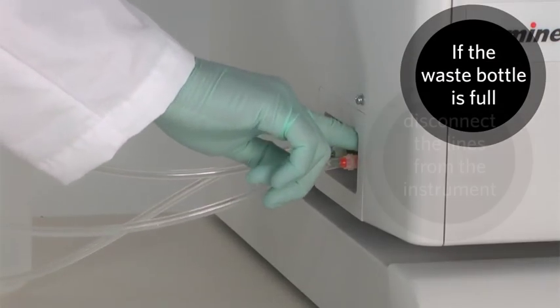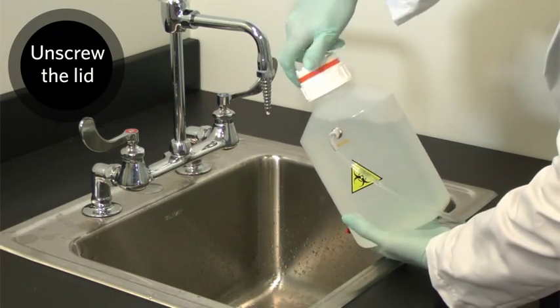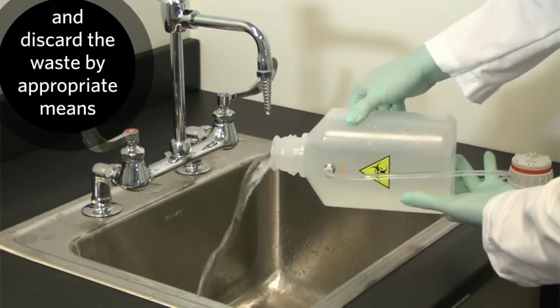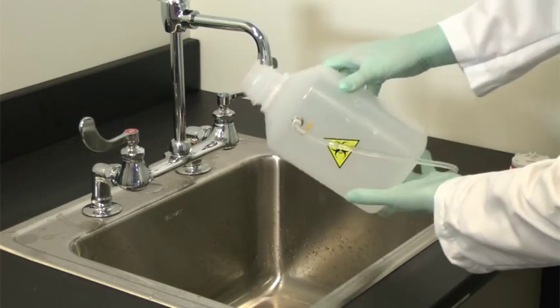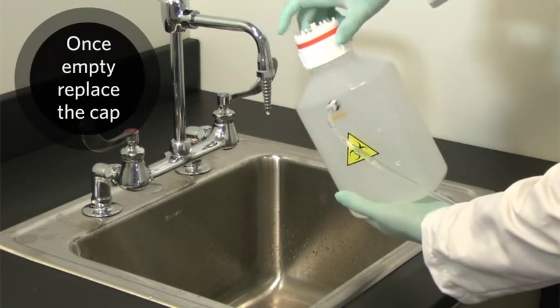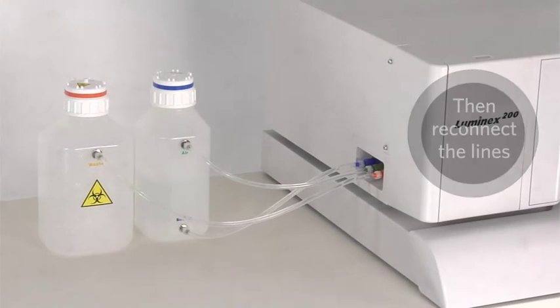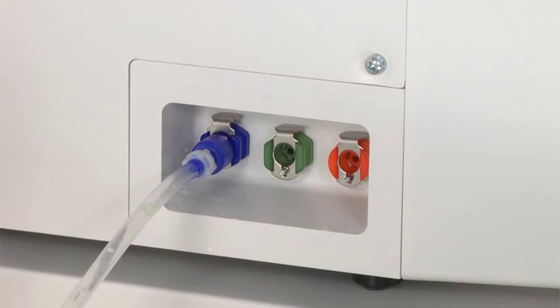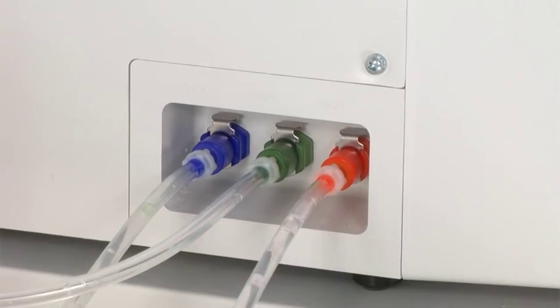If the waste fluid bottle is full, disconnect the waste container from the Luminex 200 instrument. Once disconnected, unscrew the waste container lid. Discard the waste from the waste bottle by appropriate means. After the bottle is empty, replace the cap, then reconnect the waste container to the Luminex 200 instrument. When you connect the fluid lines, listen for the connector to click. Some leaks may be fixed by making sure the connectors are seated properly. If that isn't the source of the leak, call our technical support line.